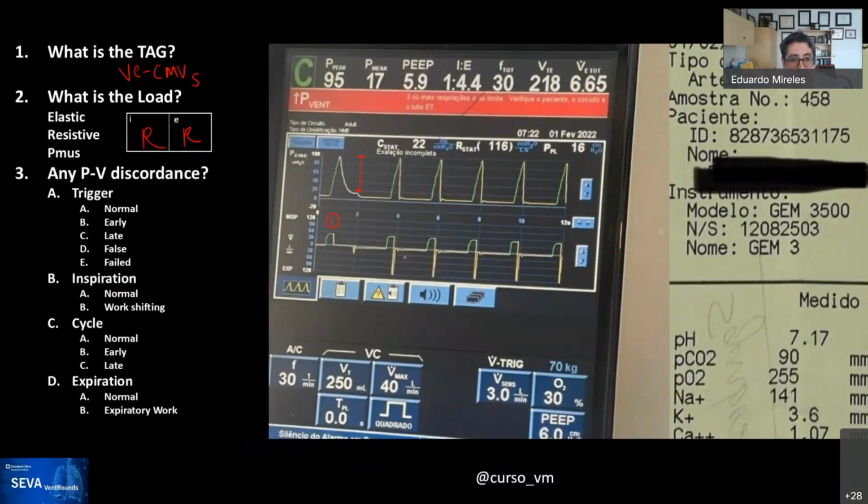Do you see any patient ventilator, any patient activity now? No, I really don't. Okay, excellent. Very good, Gaurav. I appreciate it.